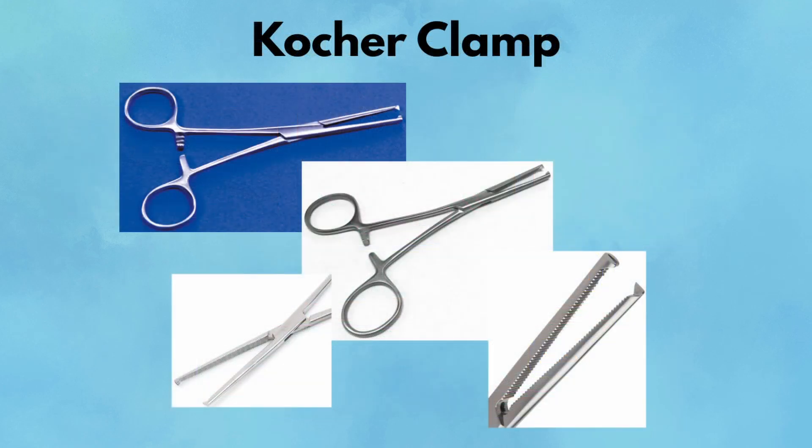Kocher clamp. This clamp is easy to recognize by its interlocking teeth at the tip. The Kocher provides a powerful grip on tough tissues, perfect for fascia, ligaments, or stubborn bleeding vessels. It's commonly used during abdominal wall closures or in trauma cases to clamp pedicles. You'll see them used in pairs to provide counter traction or to pull up thick tissues during resection. They're the go-to when slip-resistant grip is non-negotiable.